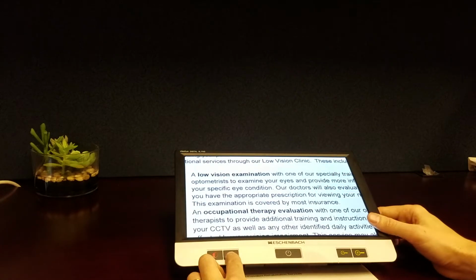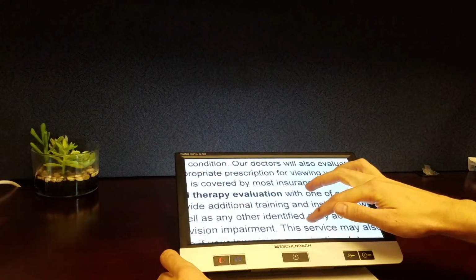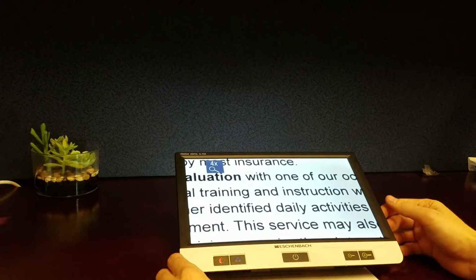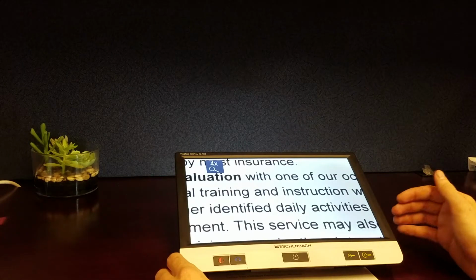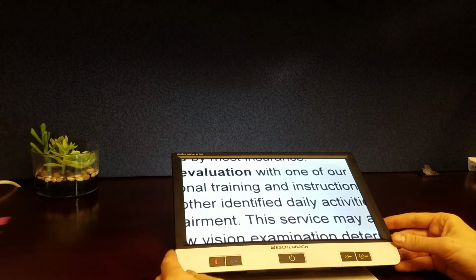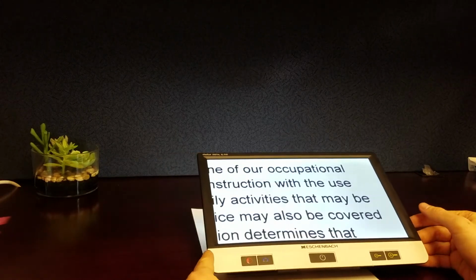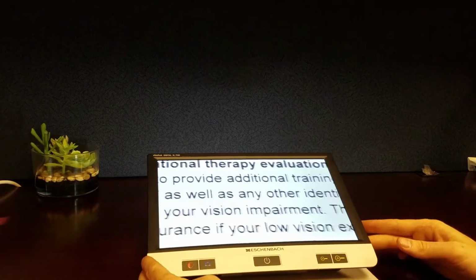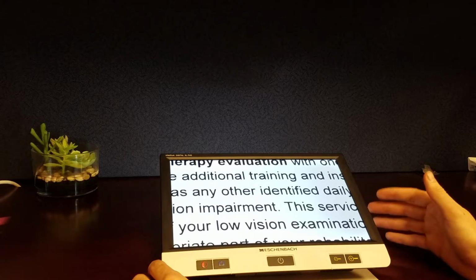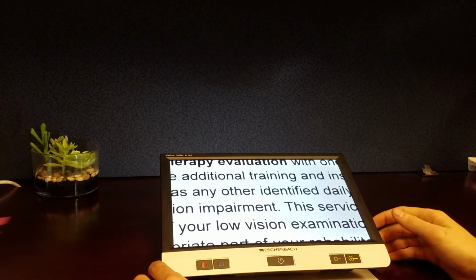And so let's hit the picture button again. We're going to go out to the live image again, and in the live image we can still use the touch screen here to zoom in and out. Now one thing which isn't possible with most handheld electronic magnifiers is the ability to pan when we're in the live mode. Well, what do I mean by that? Well, normally when we magnify we have to move the whole device left and right as we read across the sentence, like so, from left to right. With this particular device, we can actually pan left and right and up and down when we're magnified using the touch screen. Now it won't cover the entire page, but it does give us some degree of movement.